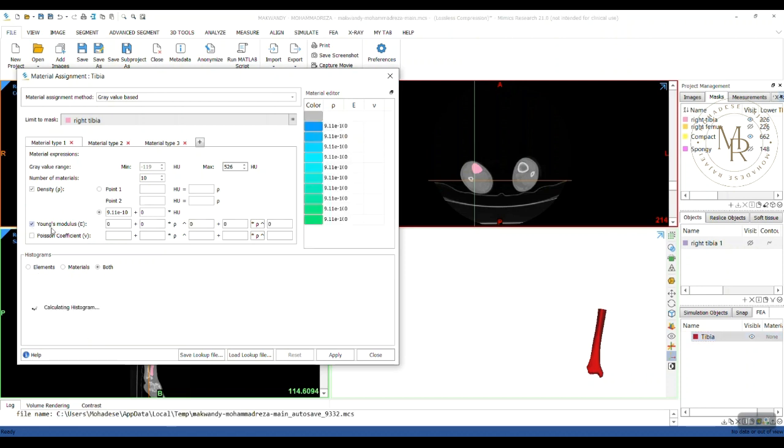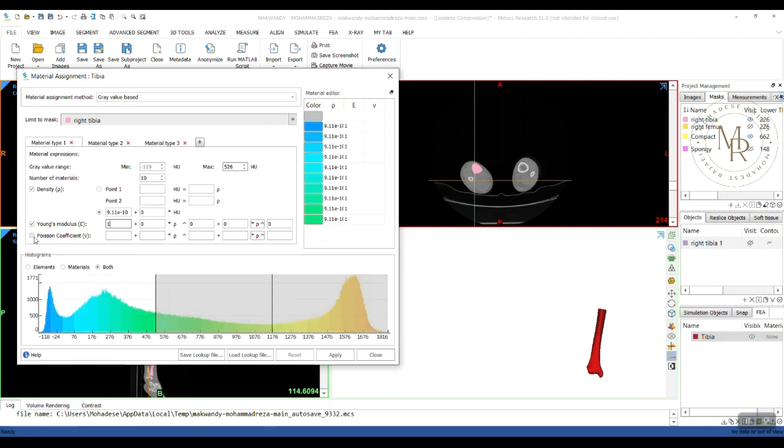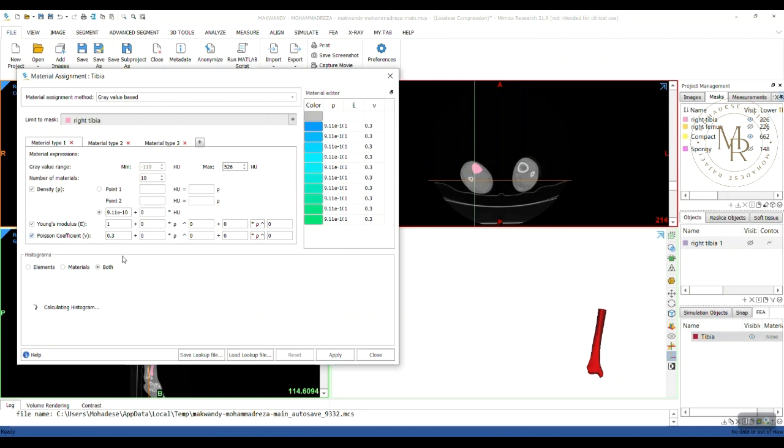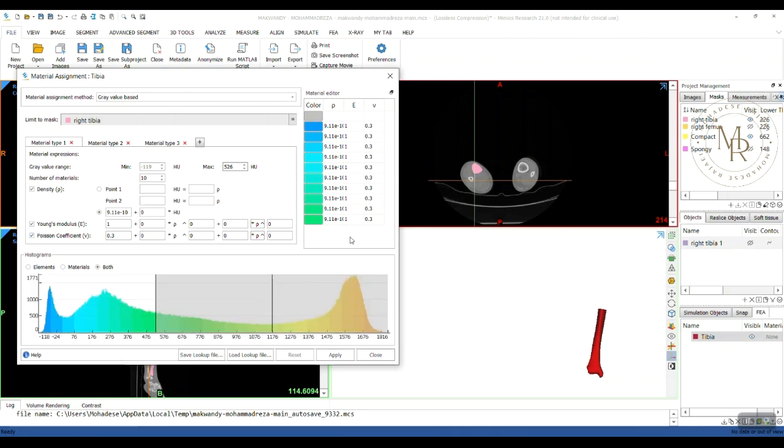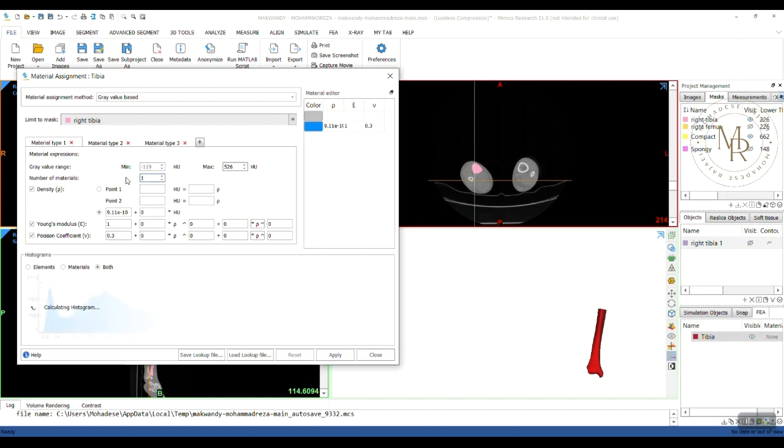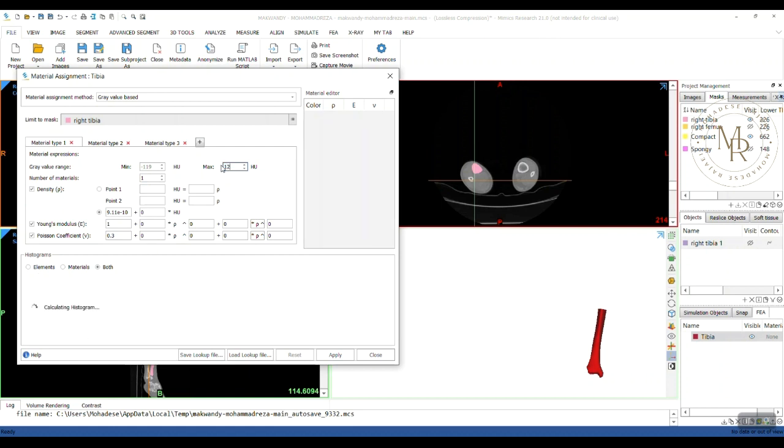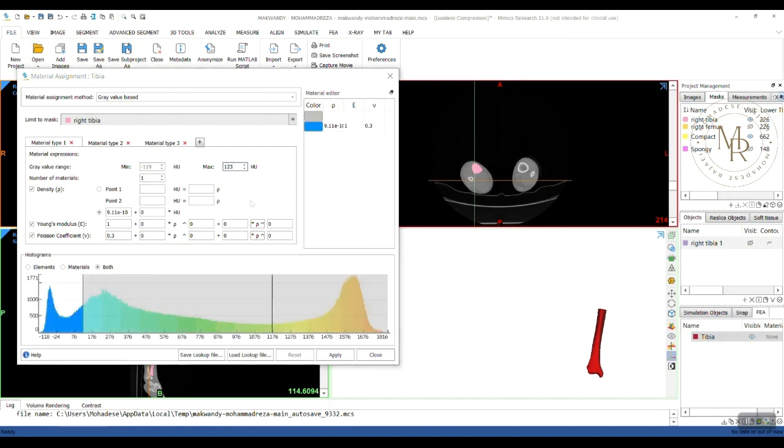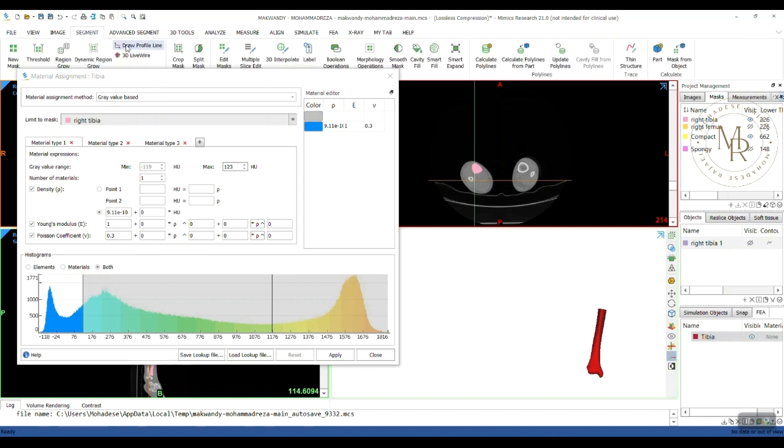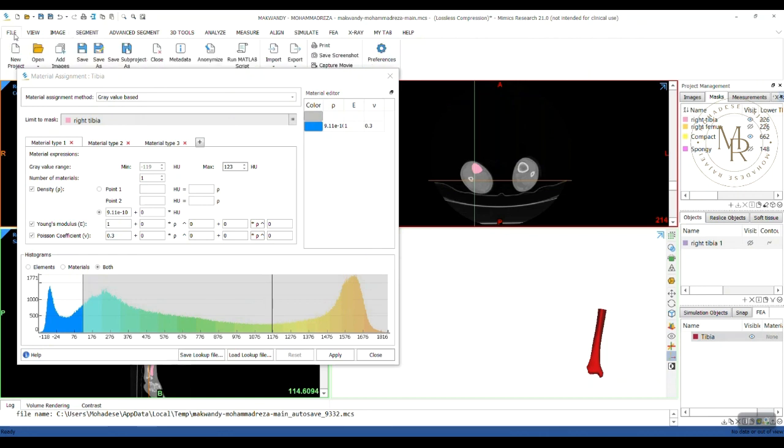Checking this box, I give 1 megapascal to fat layer and the Poisson ratio. Since the values for all layers are the same, I can reduce this to 1 layer. Also, I change the maximum value for grayscale to this. You can obtain these values for grayscale ranges for each material from papers or by drawing profile line from here.